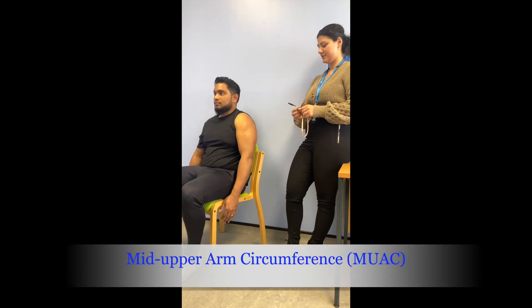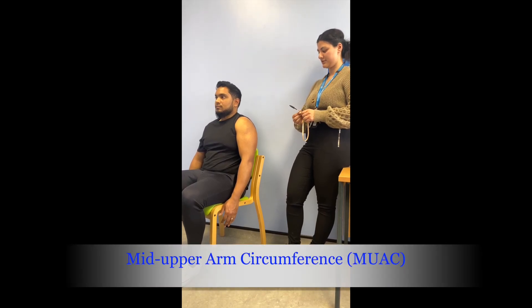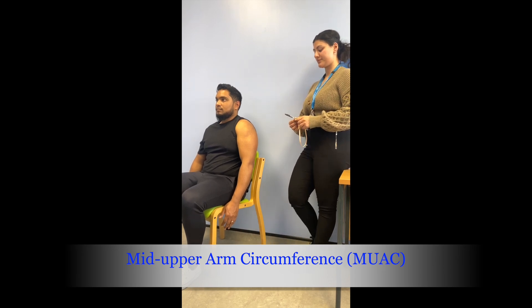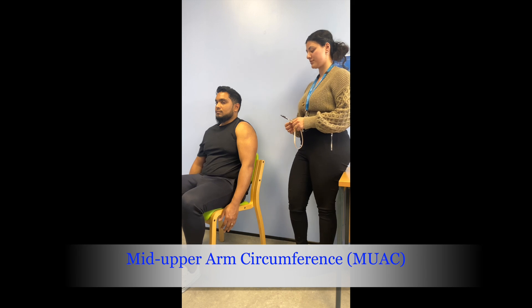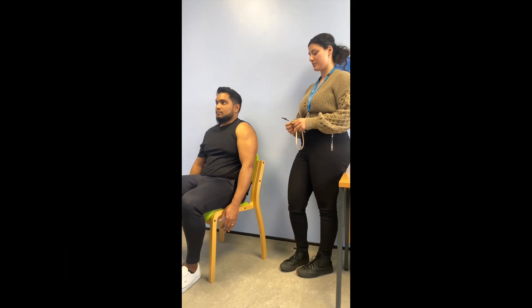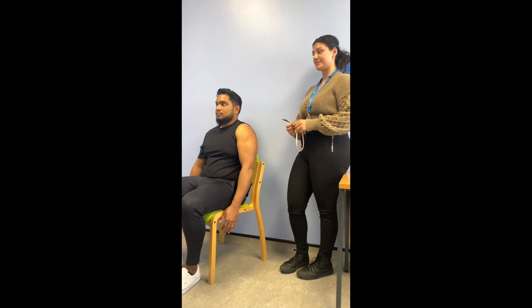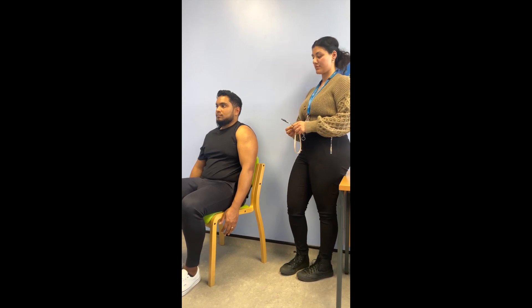If you are unable to measure your resident's weight, you can estimate their body mass index, referred to as BMI, by measuring their mid-upper arm circumference, also known as the MUAC. A resident's MUAC will indicate whether they are likely to be underweight or overweight for step 1 of MUST screening.